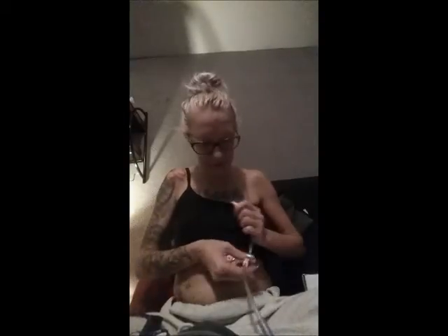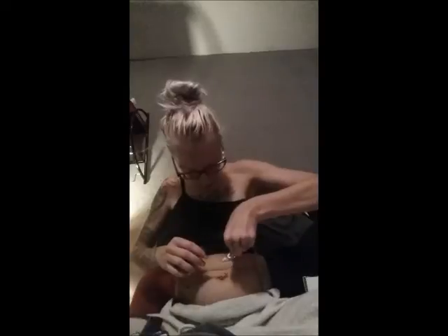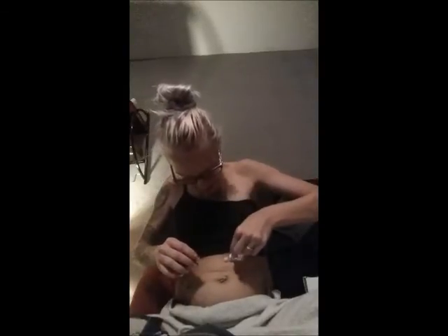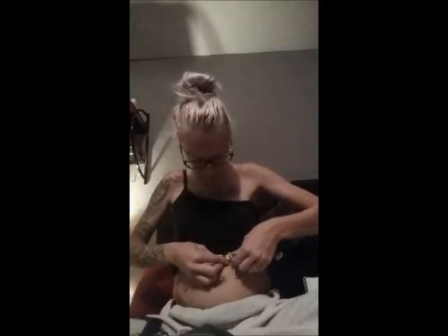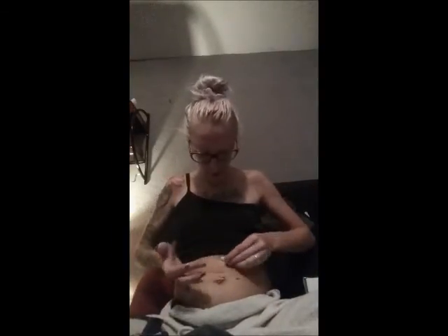It's not very flexible like the other one. It's real flimsy, and it locks in really weird. It does kind of the same thing: you have to line up the lock button, and it just locks like that. I'm going to take it out because I have gunk coming out of my feeding tube and I had it locked, so that's weird.